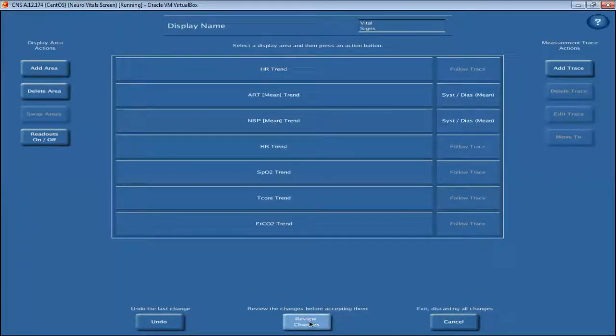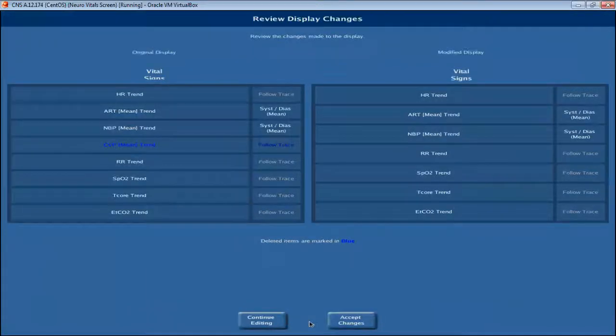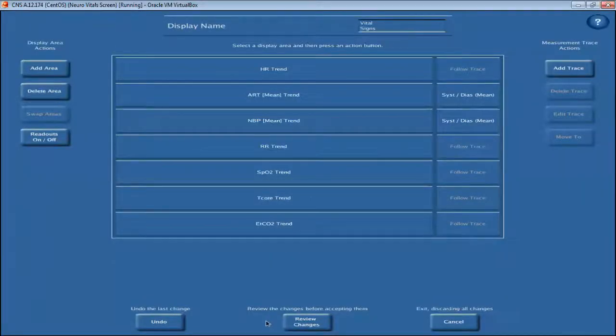So again, Tracy, that was great. I was thinking maybe share the vacant trace because I saw that popped up there, and that might be a great idea. Where you have these patients who have variable lines and monitors, but that you sometimes might want to do this or that. Sure, perfect.